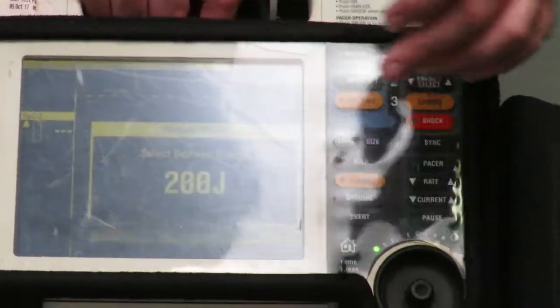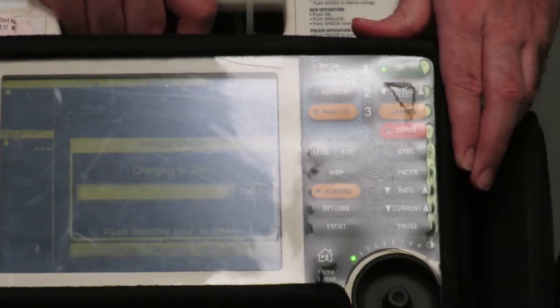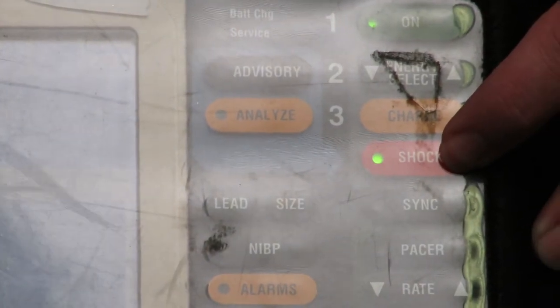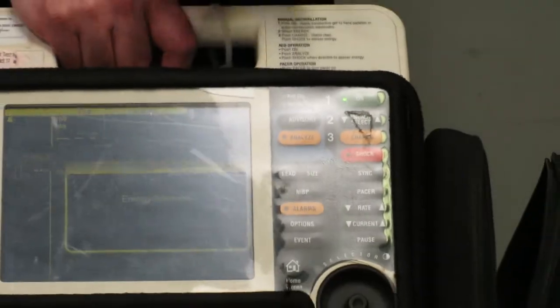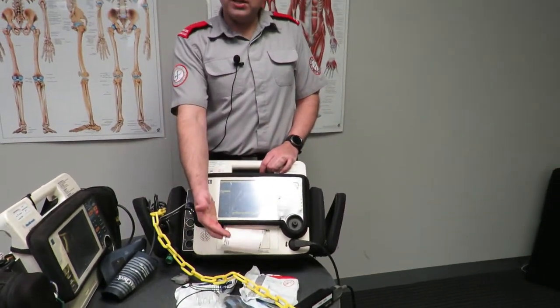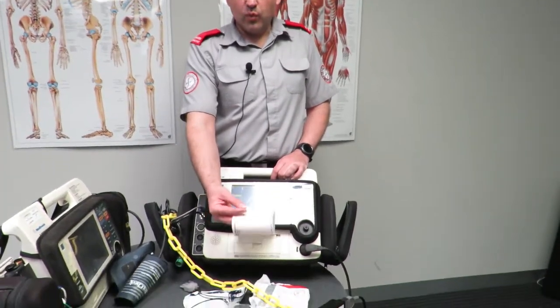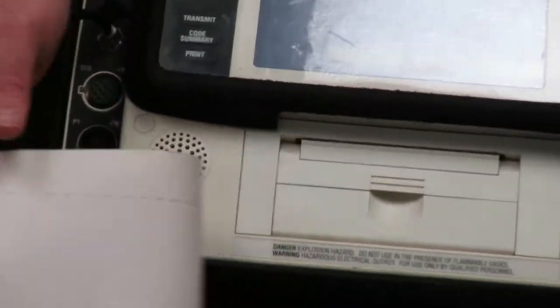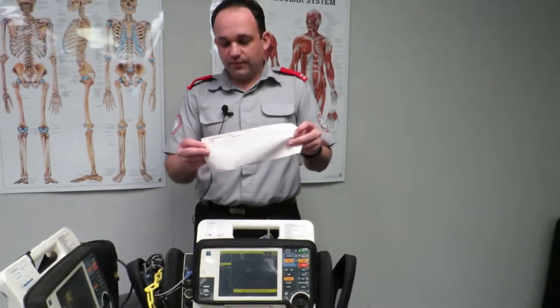Once the joule setting is selected, press charge, which is directly below energy select. The unit will charge up to 200 joules. To deliver the shock, press the flashing red shock button. That has now discharged 200 joules from the LifePak 12 into the test load, and the printer is printing out to confirm the load was successfully delivered. Once printing is done, tear that off, sign and initial it just like last time, fold it up, and leave it inside.